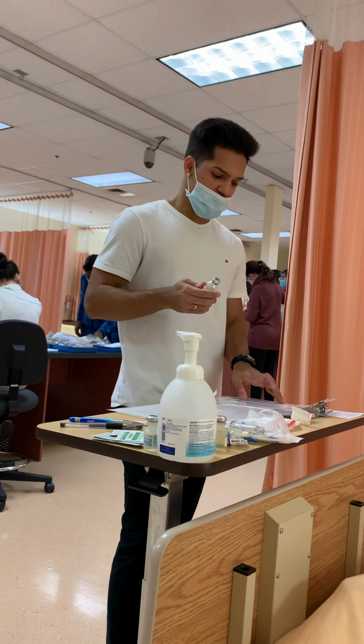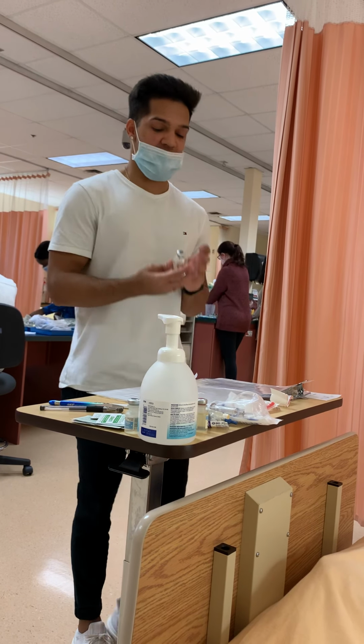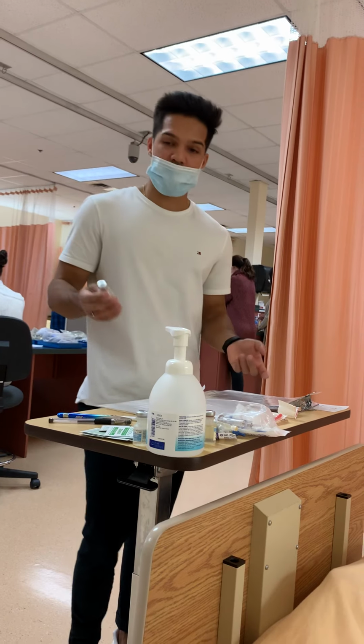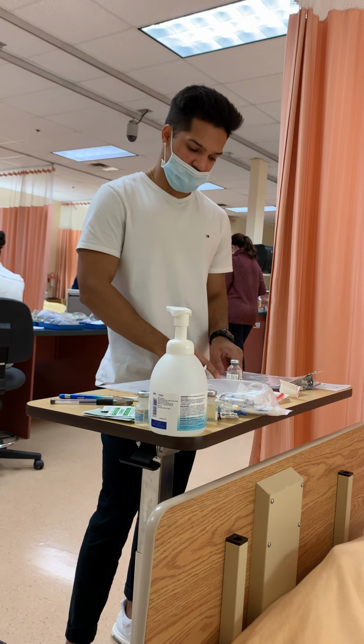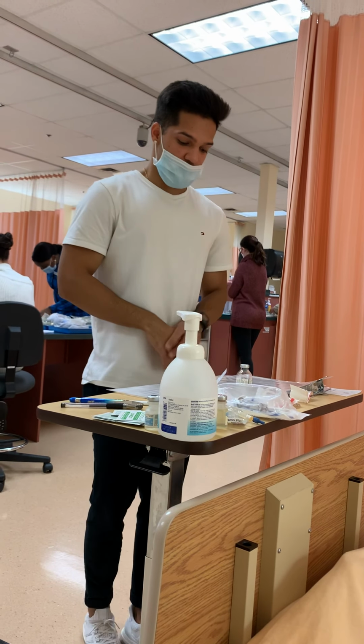First, reconstitution for my 2 gram vial: I need to add 6.8 mLs of sterile water for injection, so the final volume will be 8 mLs in this vial, and the final concentration will be 250 milligrams per mL. After that, for 1 gram doses, I need to dilute it in 50 to 100 mLs of normal saline. Over here I have 100 mLs of normal saline, and I can administer that over 30 to 60 minutes.